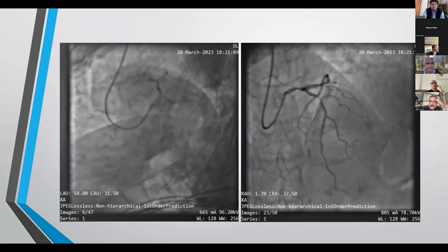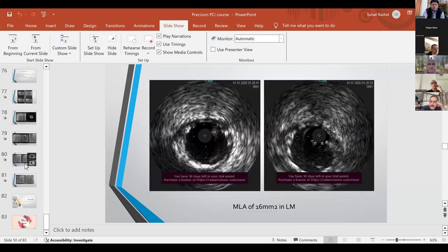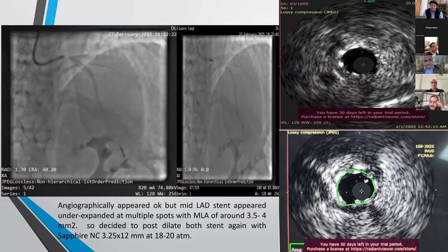And the cost goes down to where we charge the patient around 45 or 50,000. That's true for IVUS and FFR, IFR also. So that's what has significantly increased our use of all these things. I'm hoping that by Pakistan Live, I should have those guidelines vetted by all the societies and endorsed by them. Then we can get council approval from our society and publish it. And then hopefully that will help us be able to use it.